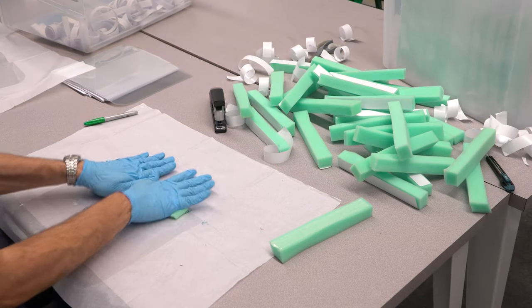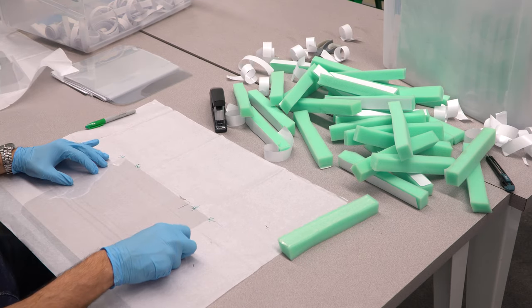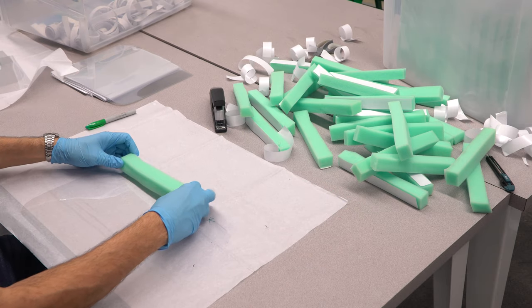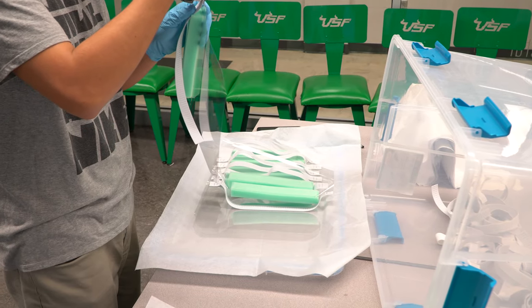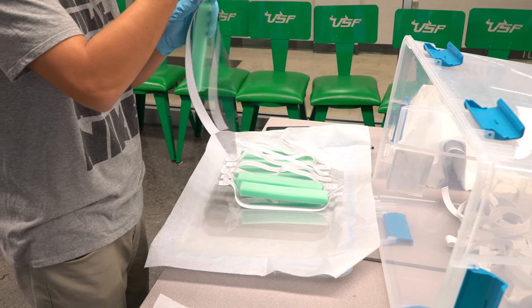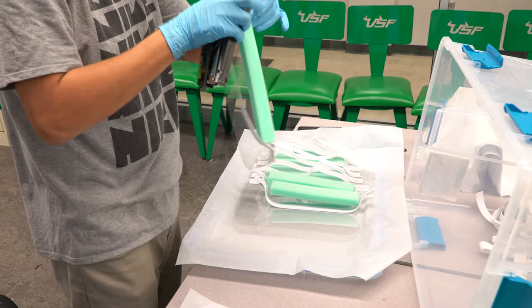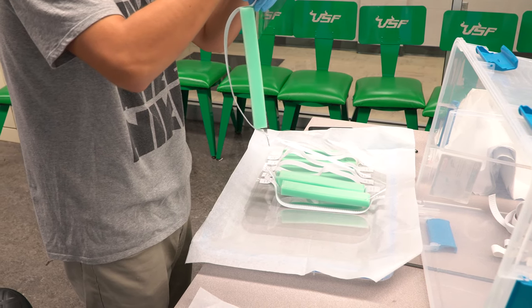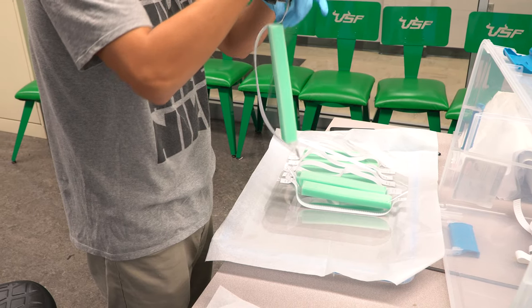After these are prepared, the foam pre-double stick taped blocks are affixed to the clear shields. The final step involves attaching, using staples, the elastic band to the plastic film with foam. After this, a quality assurance step is recommended to ensure that the staples do not pull out.